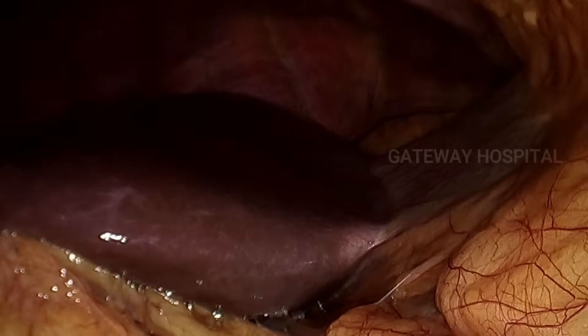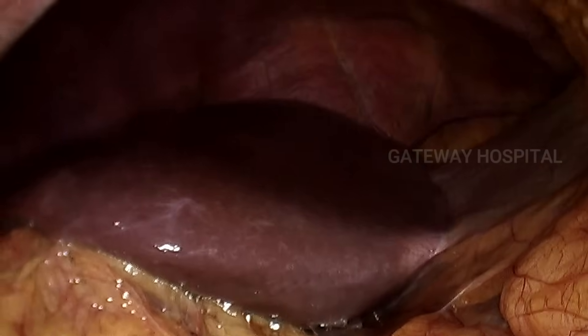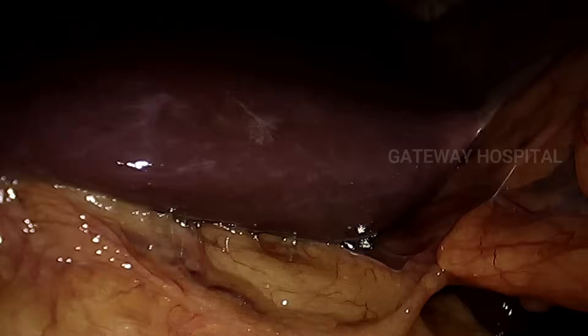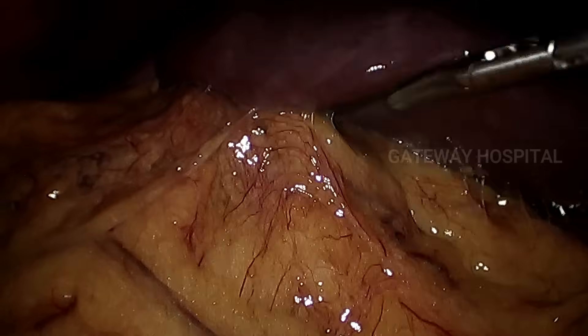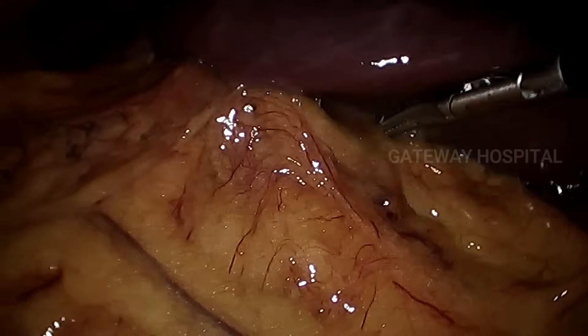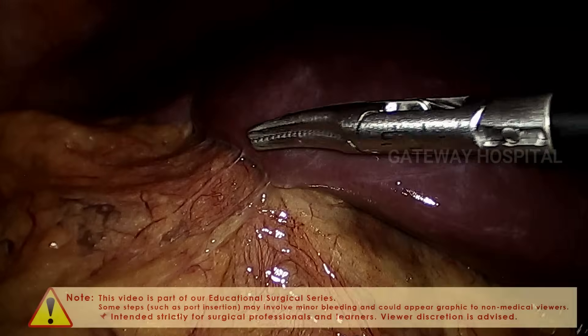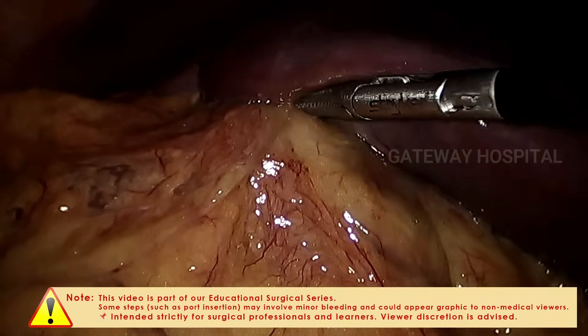Hello everyone, we are going to show a case of gangrenous gallbladder which was operated by laparoscopic approach. The ports are similar to standard laparoscopic cholecystectomy. 10mm and 5mm ports are inserted, and once the scope is introduced you can appreciate there is a mass in the region of the gallbladder completely covering the entire gallbladder.